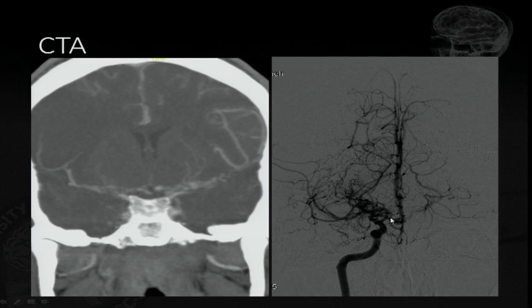And now we have something more objective. So you can do a CT perfusion after. You send the patient back, and then you pick up on this and this. Oh, you know what, let's bring it back and do the CTP.